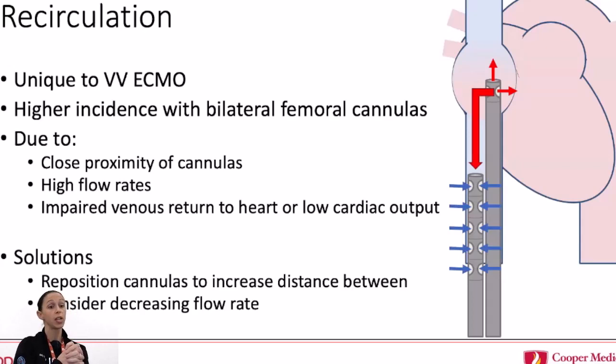So essentially, you sort of develop these two parallel circulations. So what you want to be doing, this is your drainage cannula here on screen left with all these drainage ports. And that's sort of your rate limiting step. How much blood you can drain from a patient largely determines how well you can flow, which typically dictates our oxygen levels. In this case, it's paradoxical because we're flowing great and yet we're hypoxic.